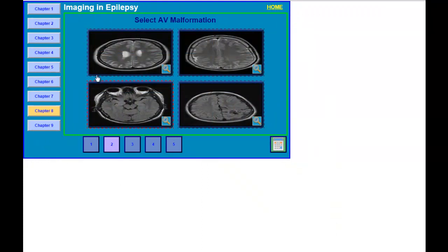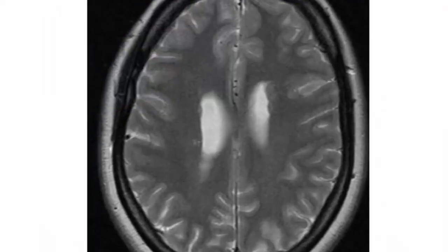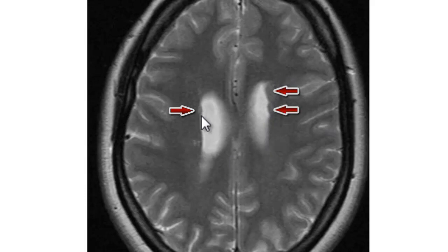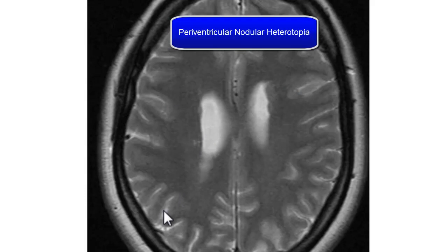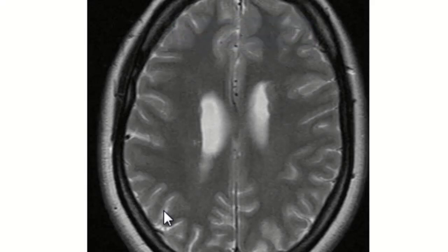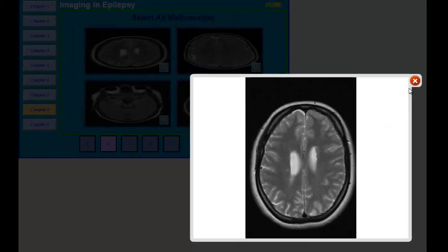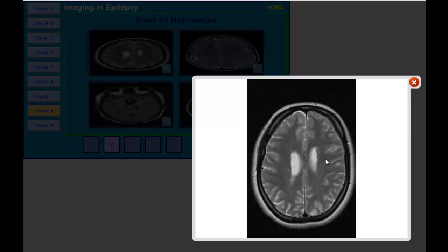The next question is to select an AV malformation. Looking at the first slide, what you see here is a finding you will rarely see in patients with epilepsy — around the ventricles, you see these nodules. These are seen in patients with periventricular nodular heterotopia, which is mostly an X-linked condition. Patients present with a history of frequent abortions and seizures, often temporal lobe type seizures. When reviewing an MRI in patients with seizures, make sure to look at the ventricles and rule out periventricular nodular heterotopia.